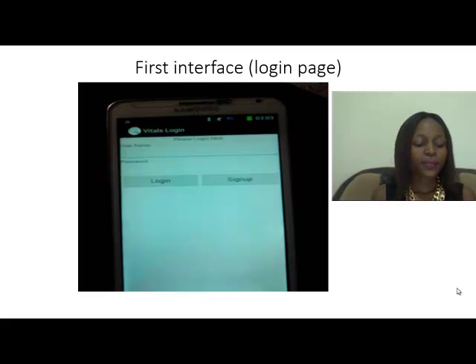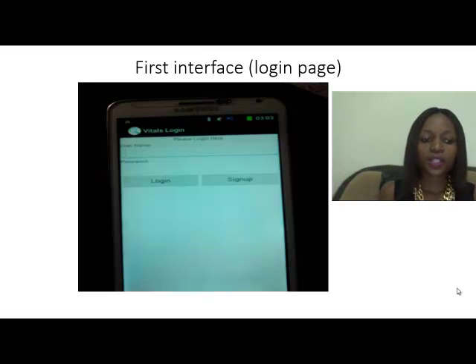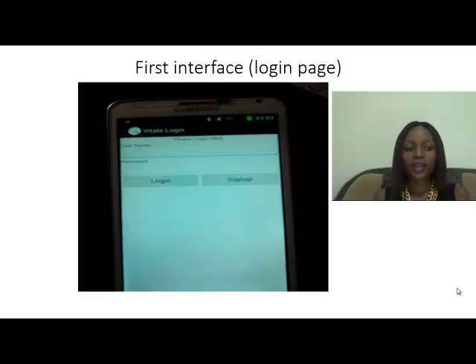And with that, because of the ICT knowledge we have as a group, we decided to design and develop a mobile-based vital assessment application that will help people measure, capture, and store their vital information. This vital tester application works in a way that by use of mobile phone sensors, the mobile device captures the heart rate, captures the temperature rate, the respiratory rate, and blood pressure.